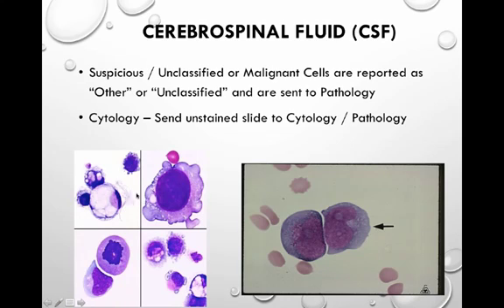So even though we might not be able to identify these cells, we should recognize that they are not our normal cells found in cerebrospinal fluid.